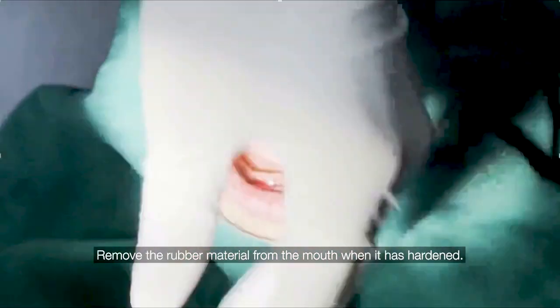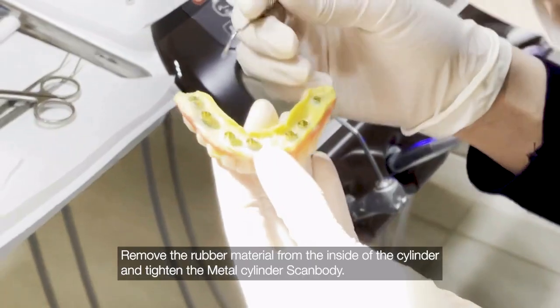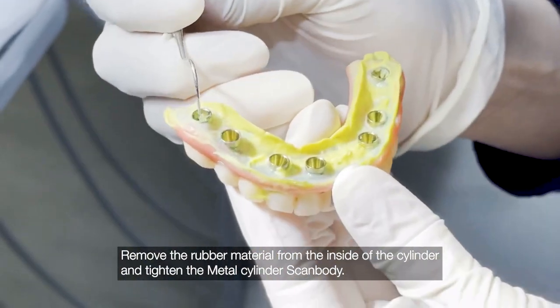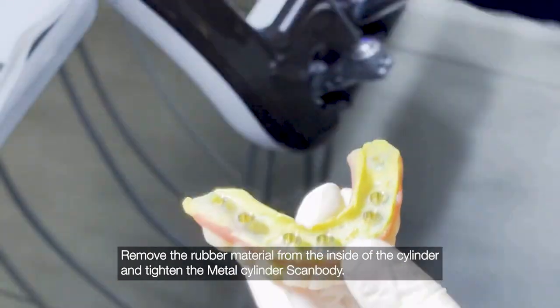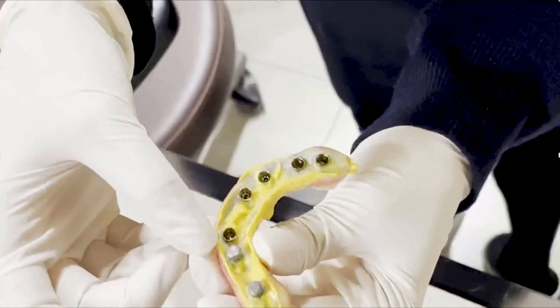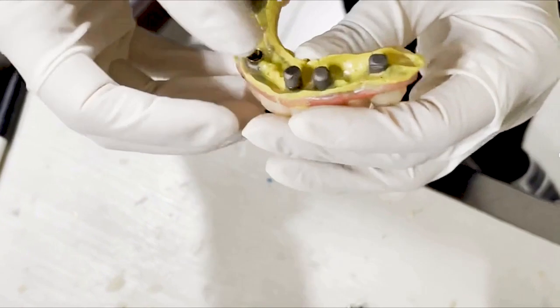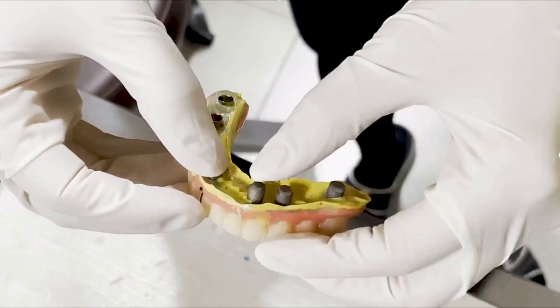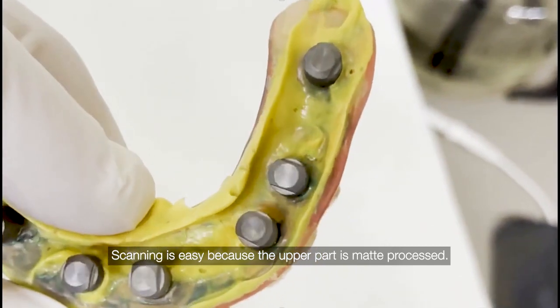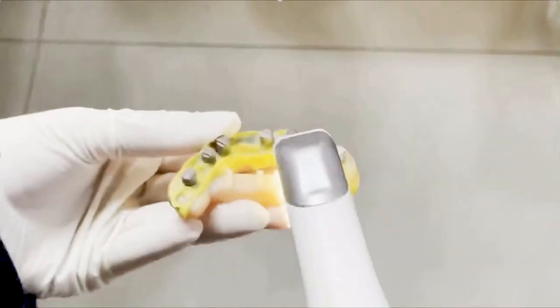Remove the rubber material from the mouth when it has hardened. Remove the rubber material from the inside of the cylinder and tighten the metal cylinder scan body. Scanning is easy because the upper part is matte processed.